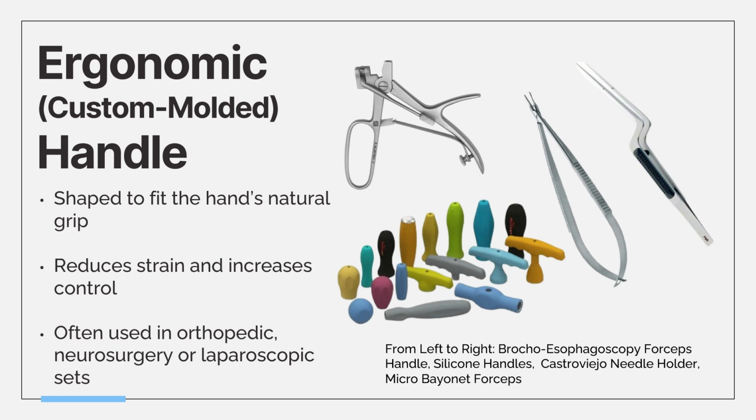And our final one is actually an ergonomic or custom molded handle. So these handles are designed with human hand anatomy in mind, often featuring curves, softer materials like silicone here, or finger contours for maximum comfort and control. This helps reduce strain, hand fatigue, and repetitive stress injuries, especially during long or complex procedures.